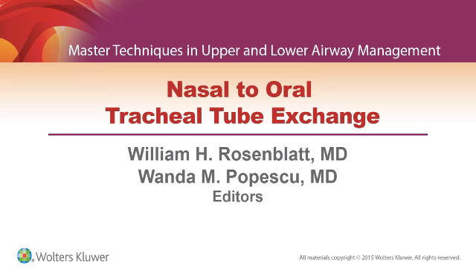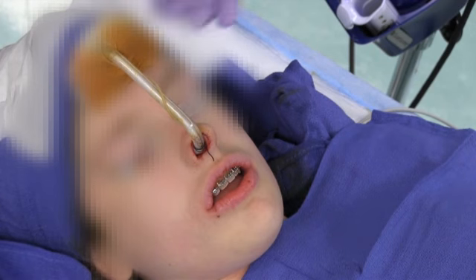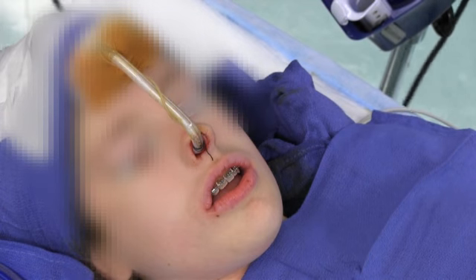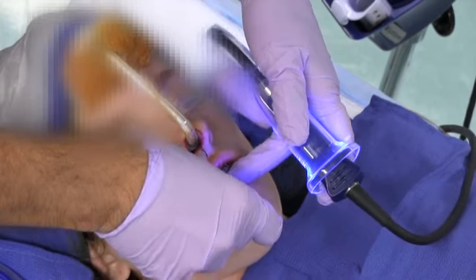A nasal to oral tracheal tube exchange may be requested for certain maxillofacial surgeries. In the following case, a young woman has had a mandibular advancement, which will now be followed by a septoplasty. At the start of the procedure, the young woman was intubated with a nasal tracheal intubation.